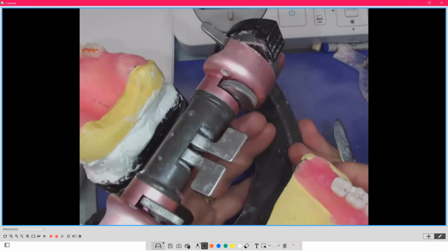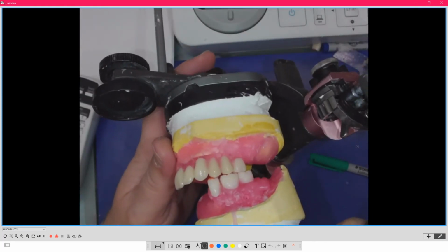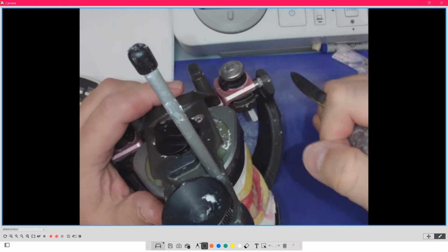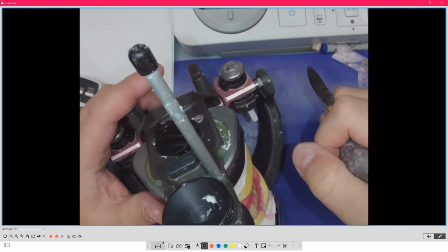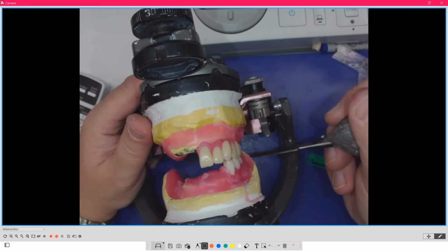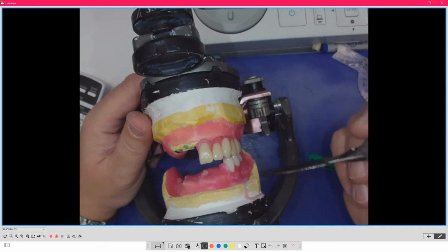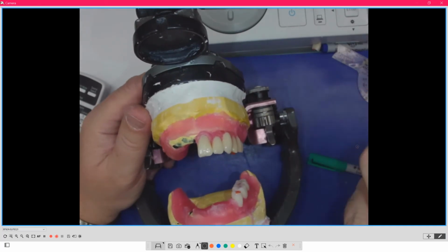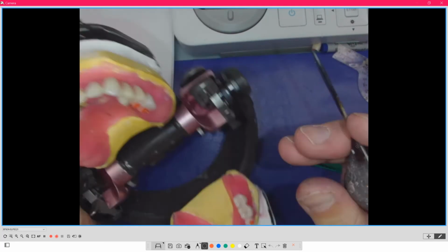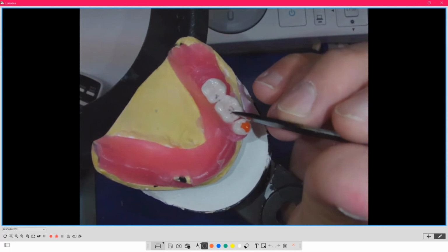It's going to be hard to see on the video because now these marks are going to be very finite. And we're used to seeing with articulating paper these big blotches of marks. No, this is finite because remember, we deal with the width of a human hair. If it's off by the width of a human hair, it's like it's 6 miles. I don't need this big mark. I color this to show me the very, very finite marks that you get here.